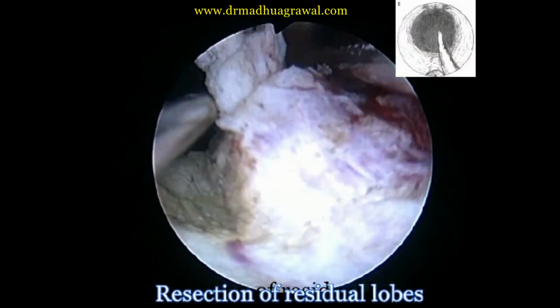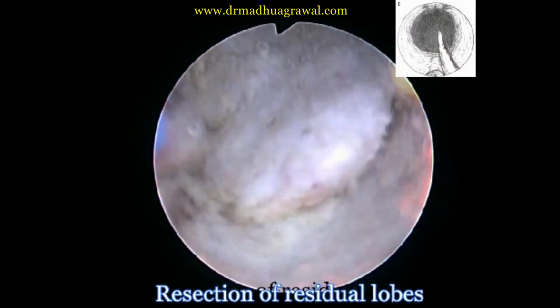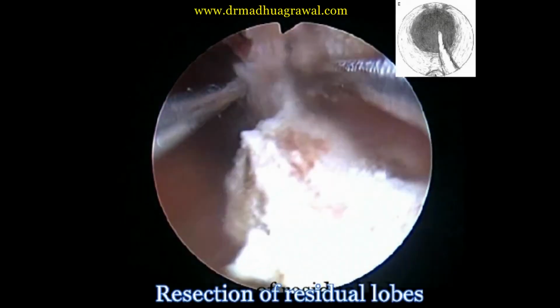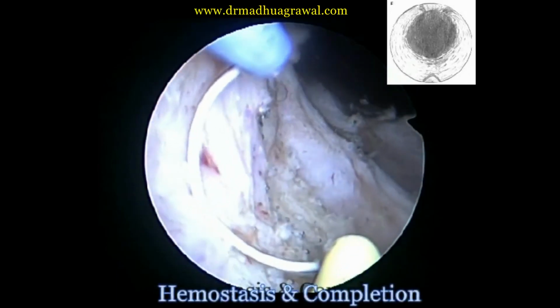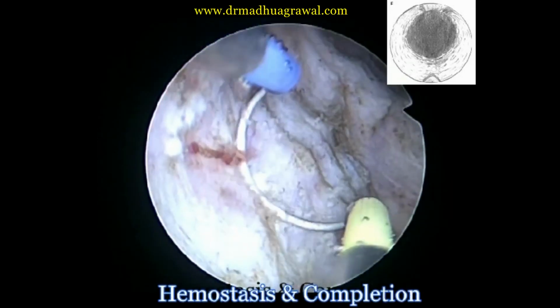With both lobes enucleated and devoid of blood supply, they are quickly resected with a cutting loop into small chips which fall into the bladder. Any residual tissue left behind at the apex is mopped up. Following this, hemostasis is secured and resected tissue is retrieved.